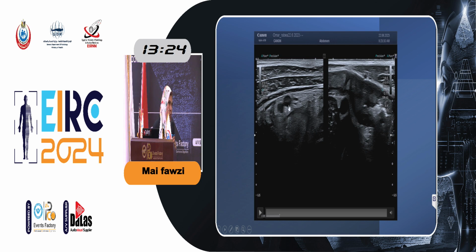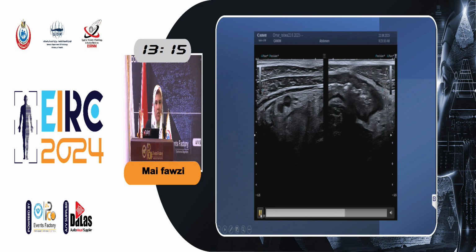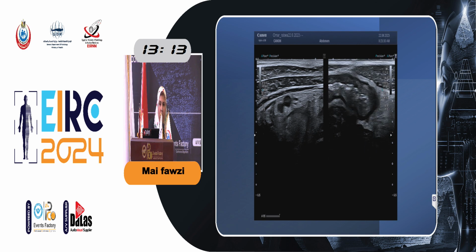The lymph nodes are not normal because there's no sinus in the center. By color, they also had peripheral and central vascularization. This is the terminal ileum of the same patient, and you can see the mesenteric fat on both mesenteric and antimesenteric border, accentuating the thickness of the bowel.